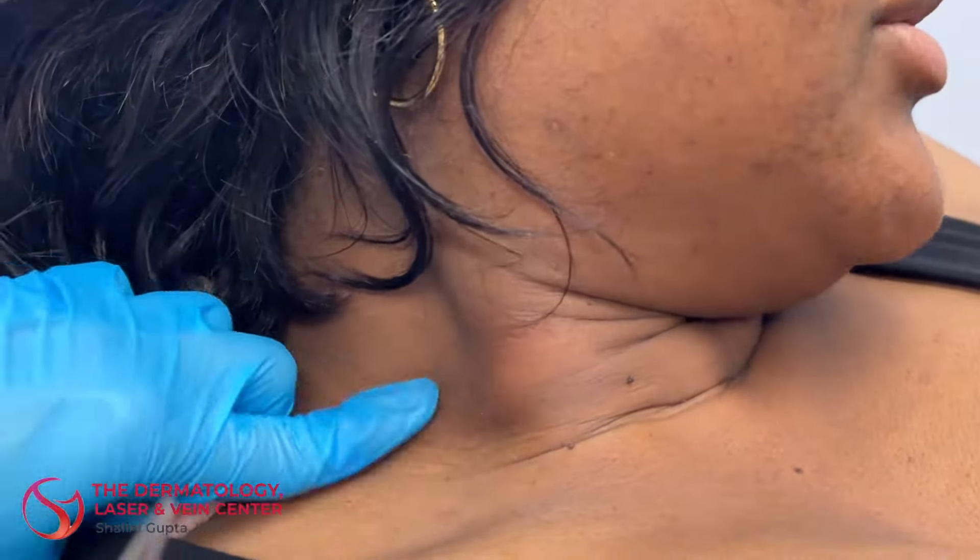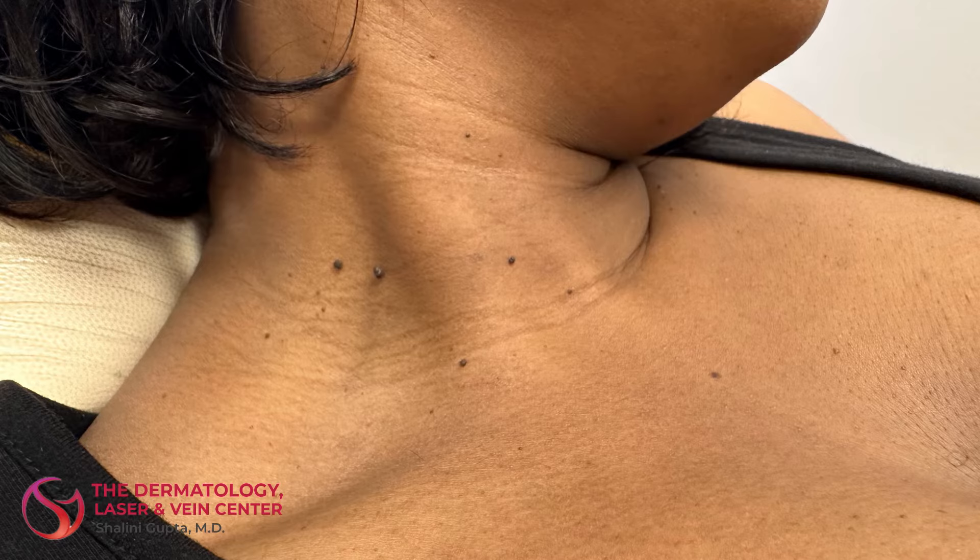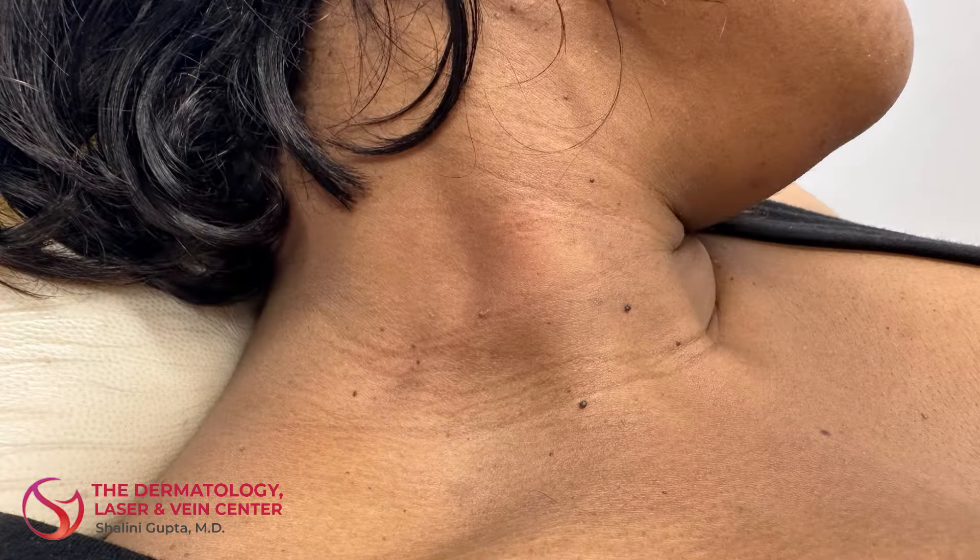And that is it. So now the skin tags are gone, the skin will heal up nicely, and won't bother her so much any longer. Thank you so much for watching.